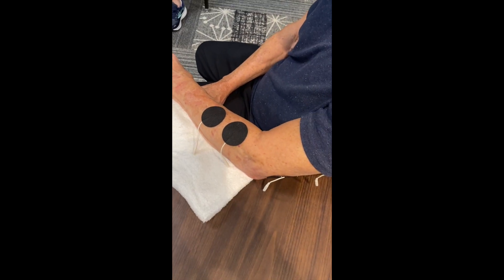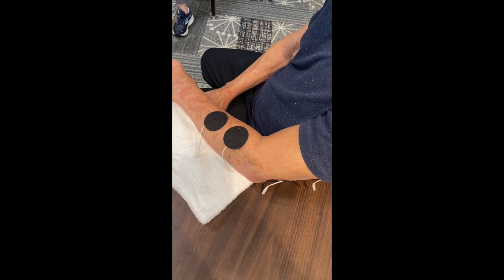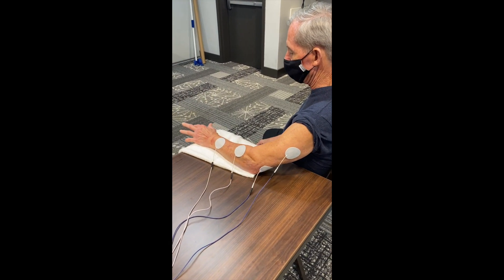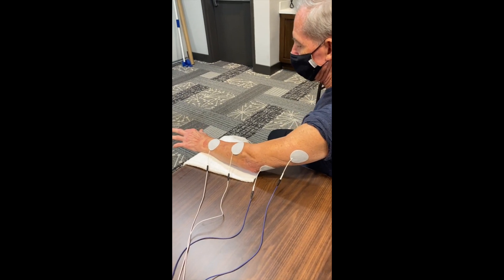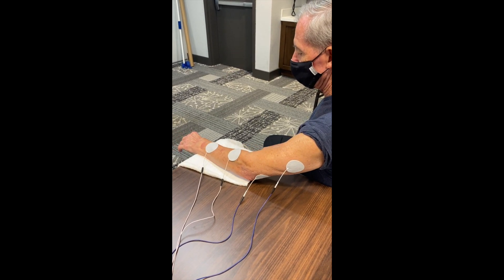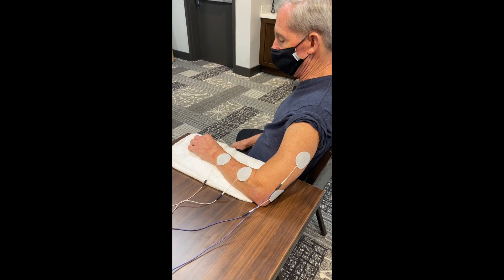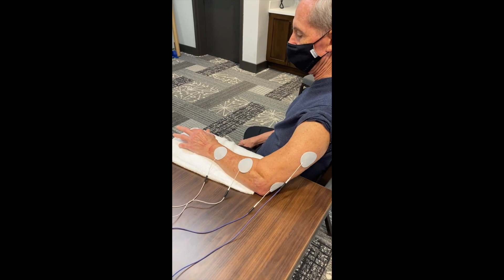So let's see what the electrical stimulation does. We have the electrodes set up. Daniel is working on elbow extension and finger extension at the same time with two channels — the triceps are activated and the wrist and finger extensors are activated. That's 10 seconds on, 10 seconds off. I'll wait for the stim to kick in, then he'll extend his elbow and extend his fingers.